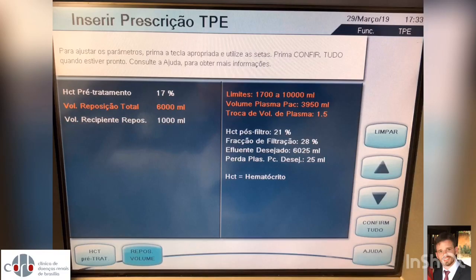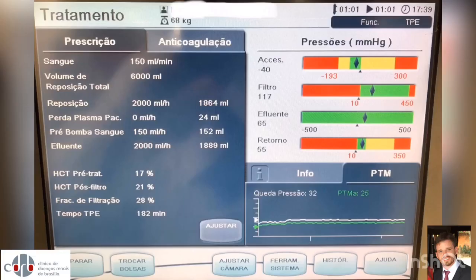Anticoagulation screen: select your total replacement solution volume and your hematocrit. Treatment screen after 1 hour of treatment. Monitor transmembrane pressure, which should always be below 50 mmHg in order to avoid fiber rupture.